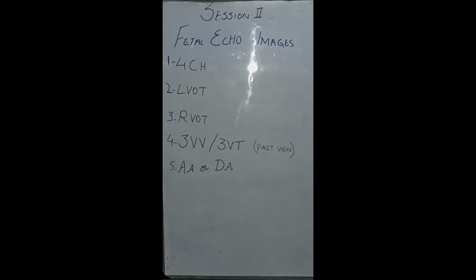Bismillahirrahmanirrahim. Assalamu alaikum. Today in the second session on fetal echocardiography, we will talk about the images required for fetal echocardiography. The basic images required for fetal echocardiography are demonstrated on the screen.